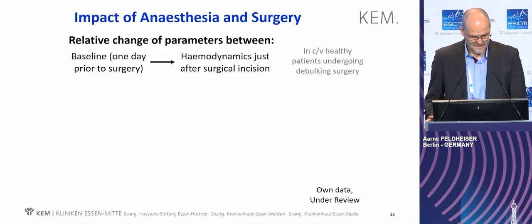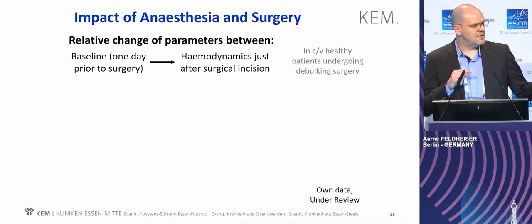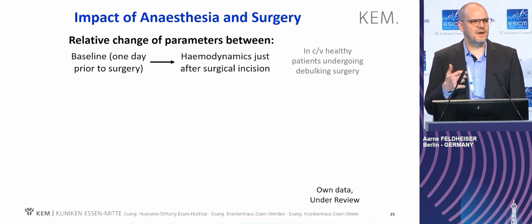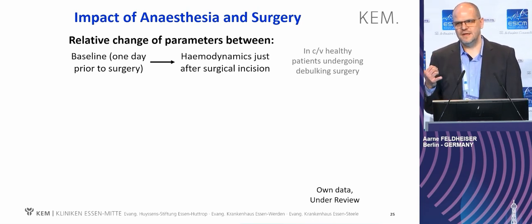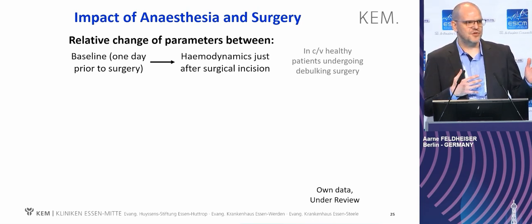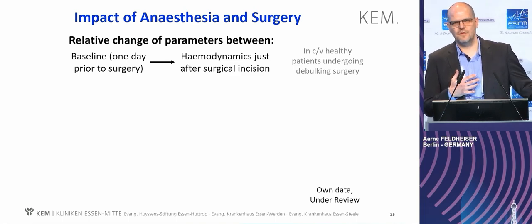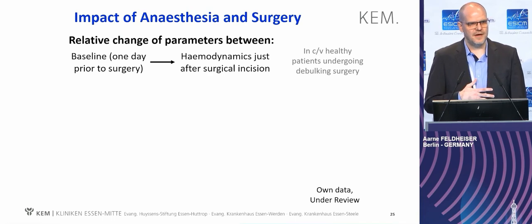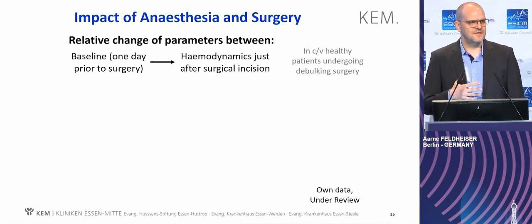We did a study we have now under review. What we did is the individualization. Professor Michard showed us, by the study of Bernd Saugel and the fatigue study, that we need perhaps in the future preoperative measurements of our patients to individualize our care. And this is with such a bioimpedance technology very easily possible.